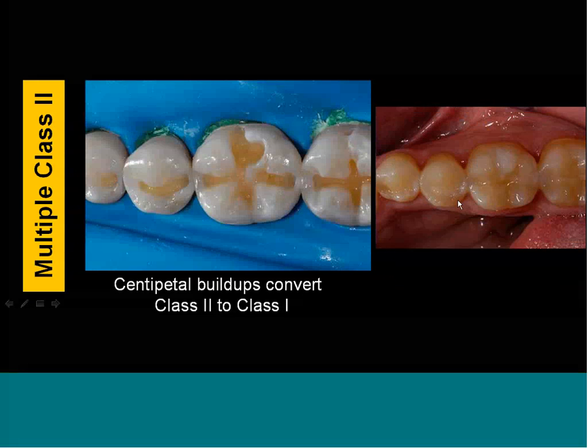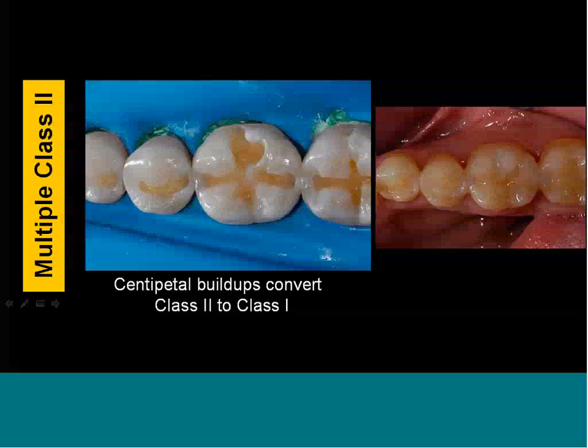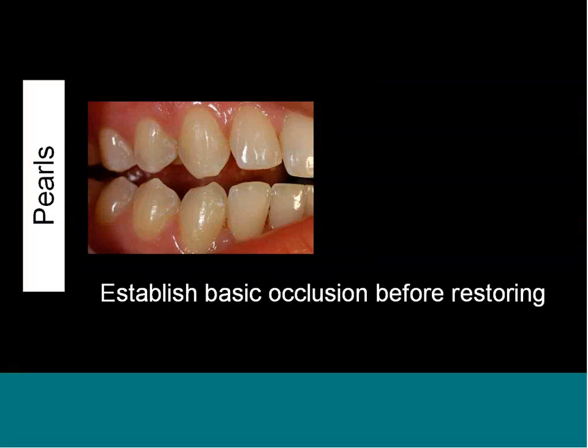So they're functional. He's going to have these for a long, long time. It's just a little too light, and I asked Jeremy if he wanted me to go in and touch these up a little, and he's fine. Most patients, they want function, they want comfort. Aesthetics is nice, but they don't notice a lot of the little nuances we do, especially when we're looking at it under photography, under loupes. It's a little different basis for how we perceive our work.